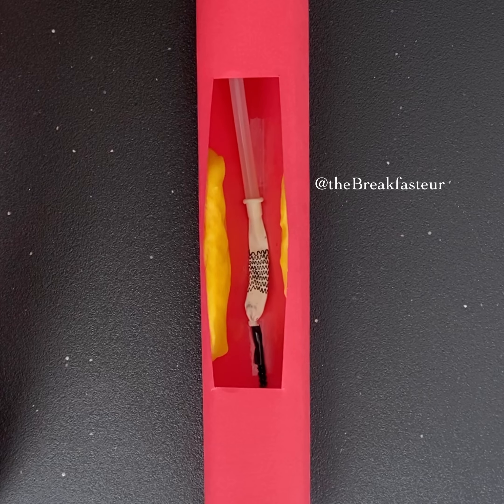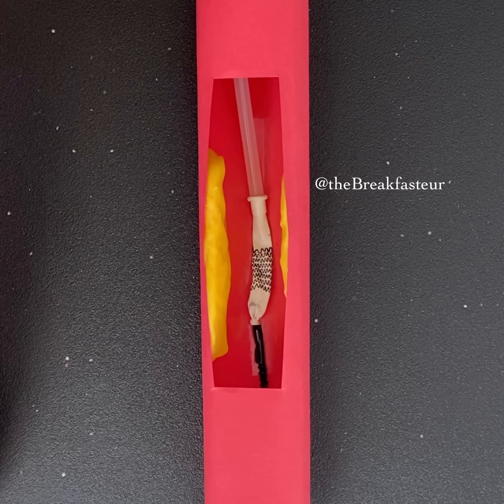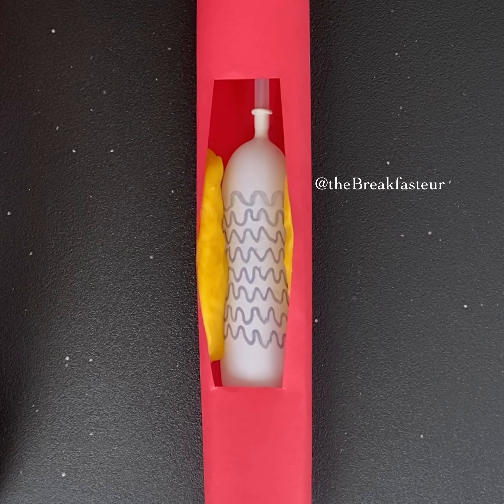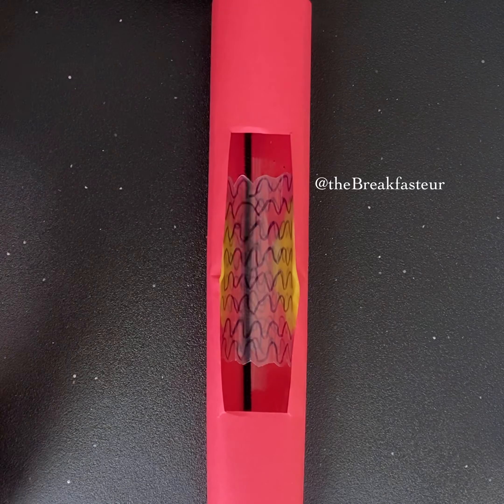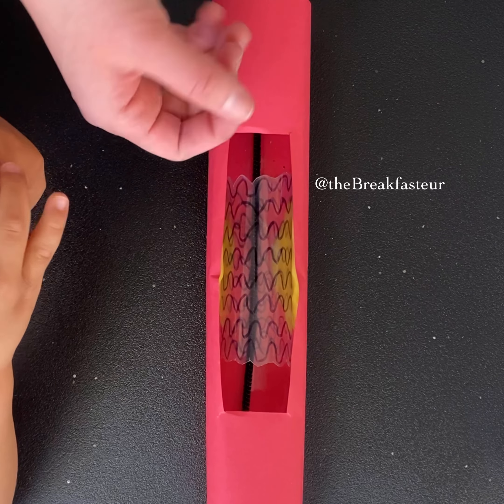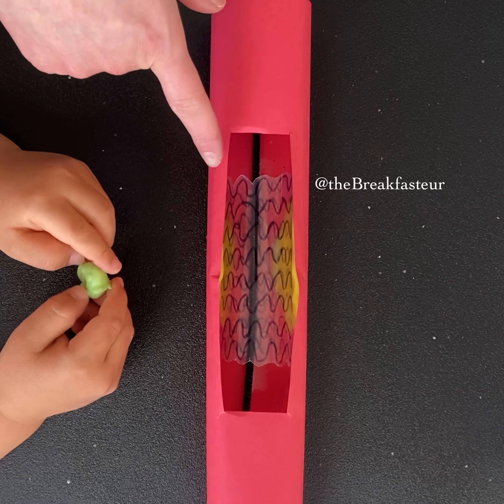This time we have a stent on the balloon. You can see that the stent is left inside the artery to keep the artery open so it doesn't close back up again.